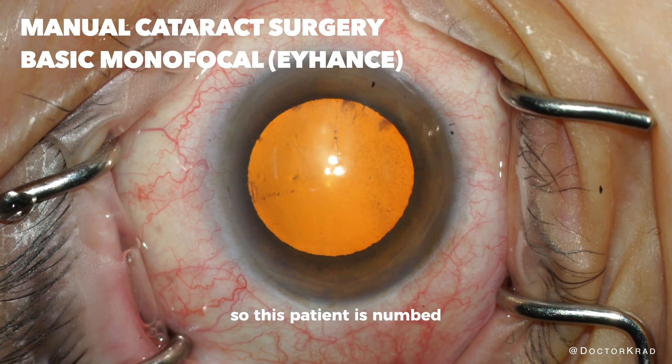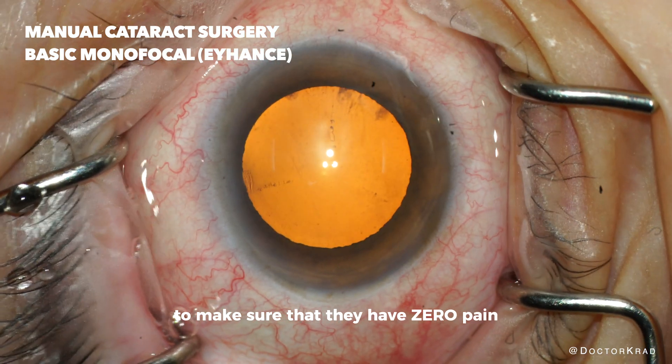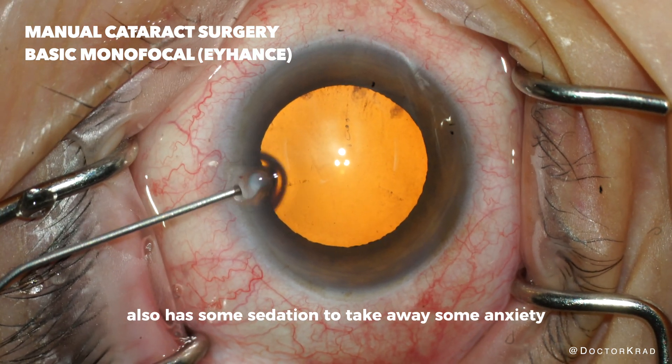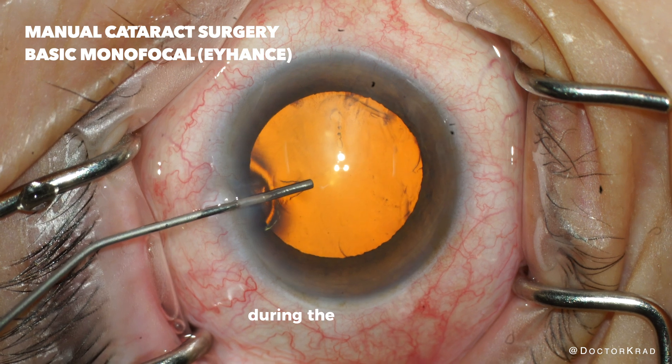This patient is numbed just with eye drops. They are awake. I'm putting some extra numbing solution into the eye to make sure that they have zero pain. The patient also has some sedation to take away some anxiety. This gel will fill the eye to maintain the structure and shape of the eye and also protect the cornea during the procedure.